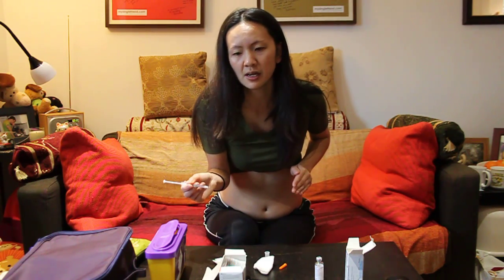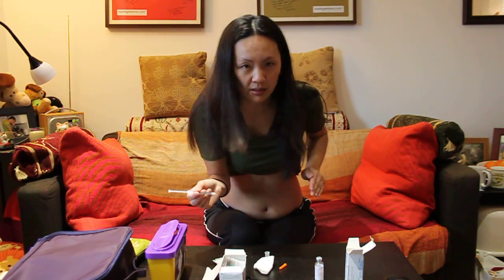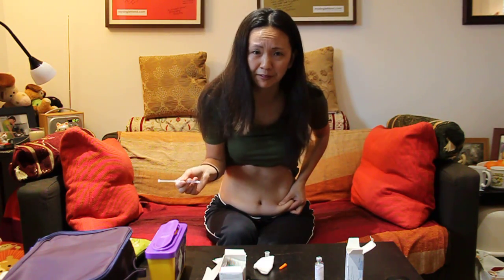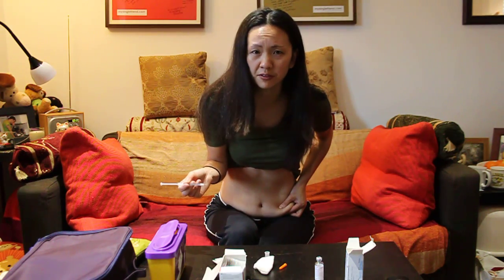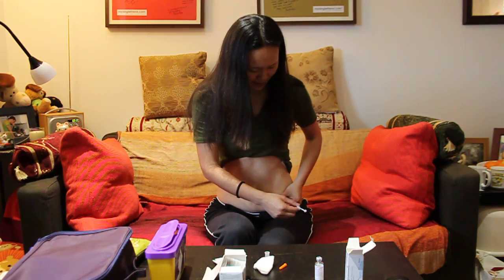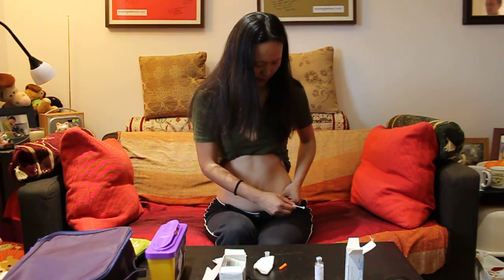If you're doing this for the first time, I understand you're nervous, but we're going to do this together and you're going to be fine. I'm going to squeeze this area. Try not to clench — I did it the first time around and it was really painful; I ended up with a red mark afterwards. So you're not going to do what I did and clench. I'm going to go in with a firm squeeze at my 90-degree angle — it's 90 degrees, trust me on this one — and I'm going to go in on a three, two, one count.